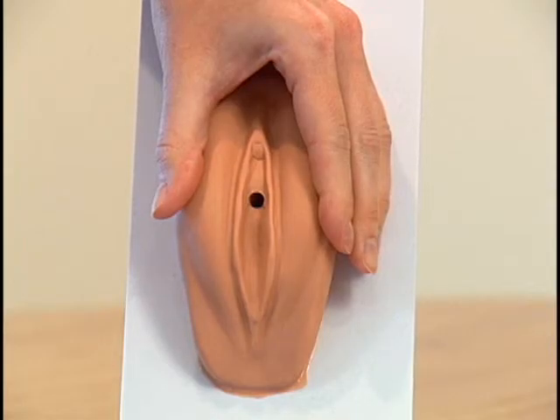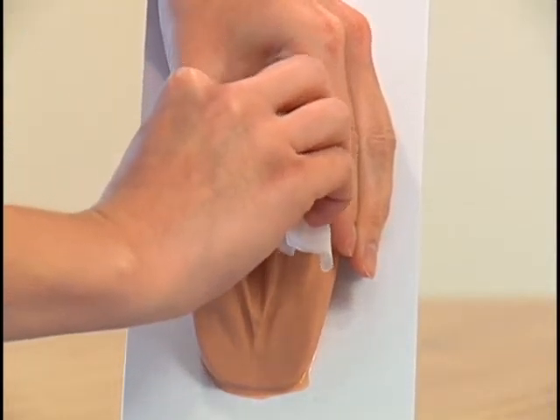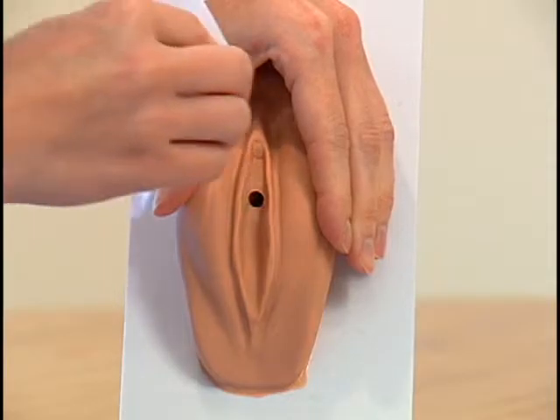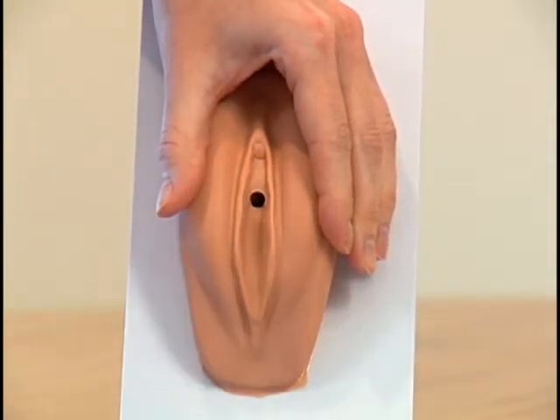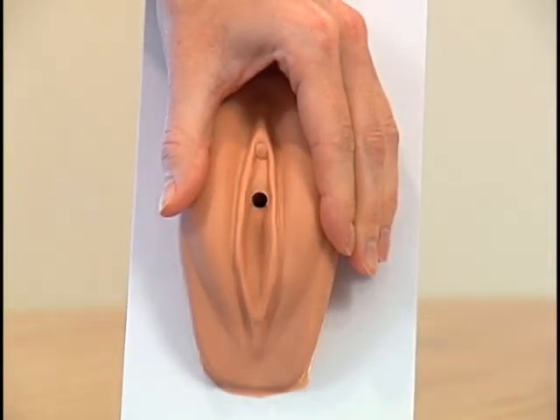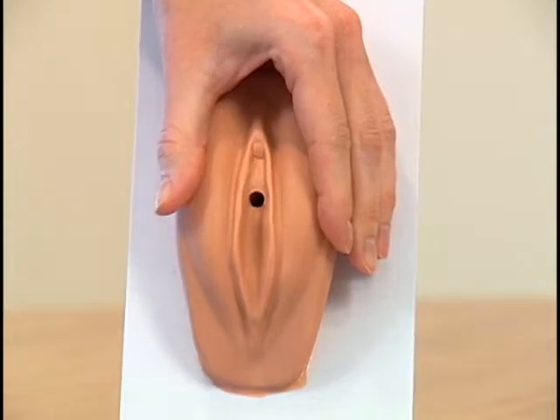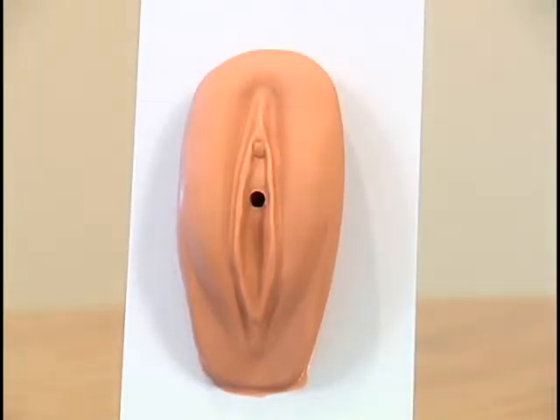Expose the urinary meatus by spreading your labia apart with one hand. Next, cleanse one side of the meatus with an antiseptic towelette using a front-to-back motion. Discard the towelette in the toilet. Now cleanse the other side of the meatus with a second towelette using a front-to-back motion, and discard the towelette. Using a front-to-back motion, cleanse directly across the meatus with a third antiseptic towelette. Discard the towelette in the toilet.